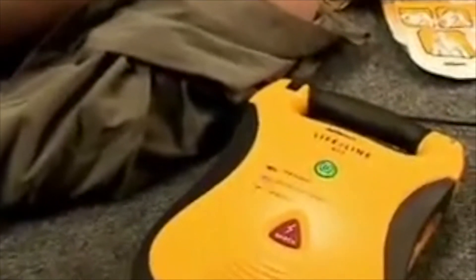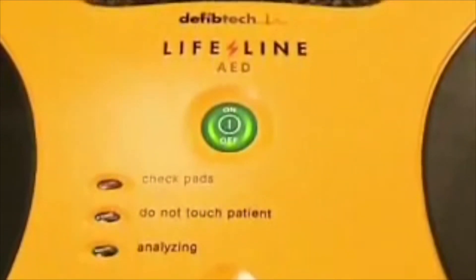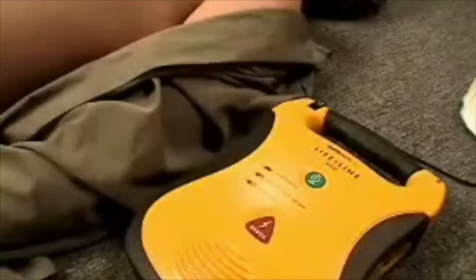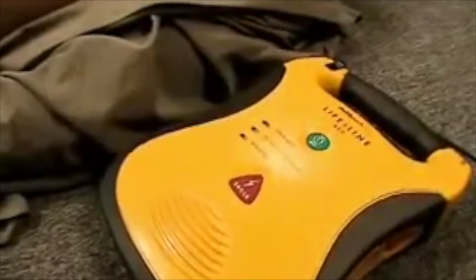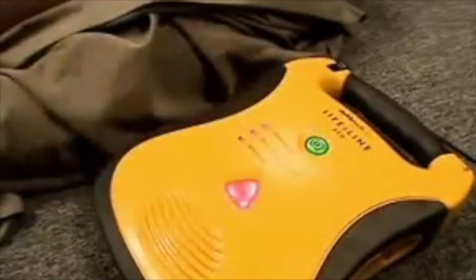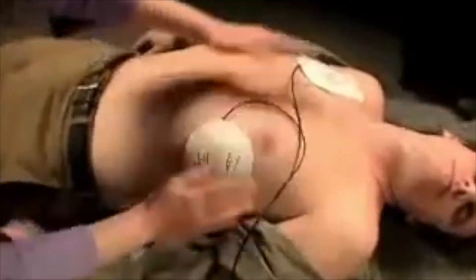The only cure is early defibrillation. At last, the revolutionary design of the DefibTech Lifeline AED makes life-saving defibrillation an affordable reality. The Lifeline AED is designed for simplicity. Once the AED is turned on, clear voice prompts and brightly lit progress lights guide the user step-by-step from applying pre-connected pads through delivering a shock.